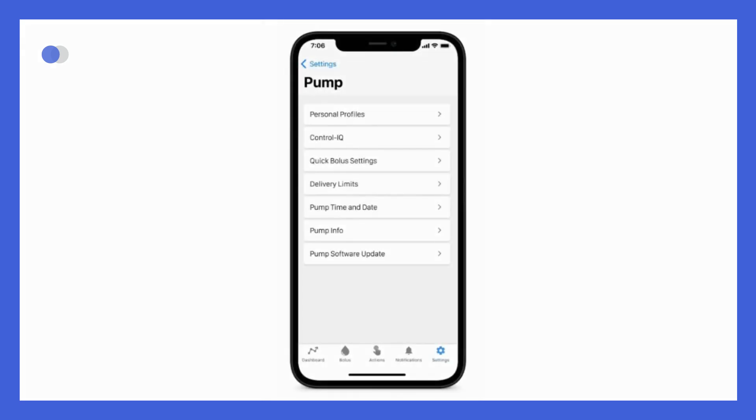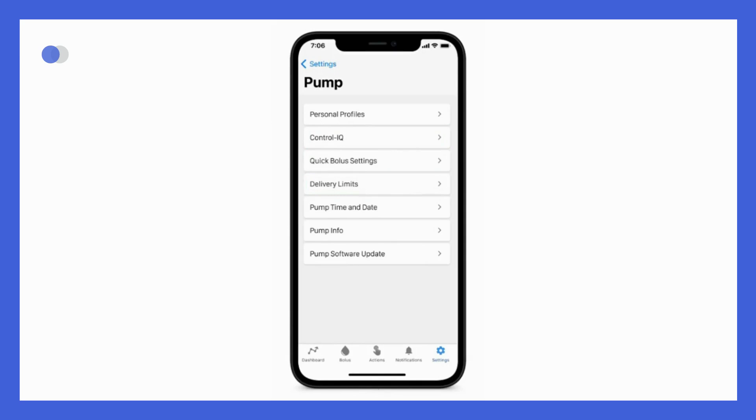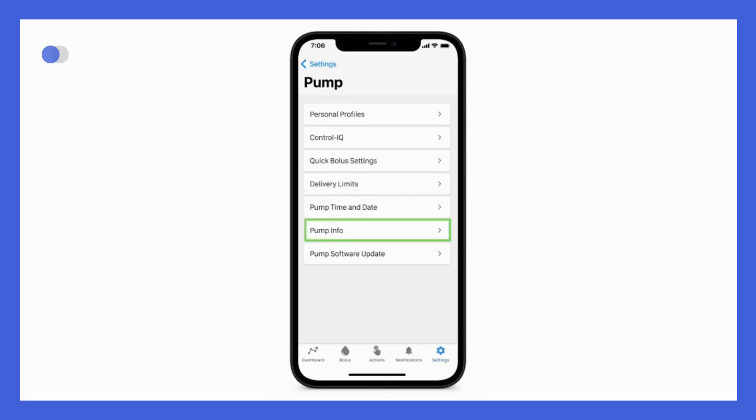Within the pump menu, you find the following. This is where you program personal profiles and where you turn on Control IQ technology. You program the quick bolus settings and delivery limits, which are the max bolus and basal rate limit values. You program the time and date for your pump from this menu. So this is where you need to go after the time changes or when you travel to update the time on your pump, since it is not automatically updated when the time on your phone changes. You can find pump info and at the bottom is where you go to update your pump software.